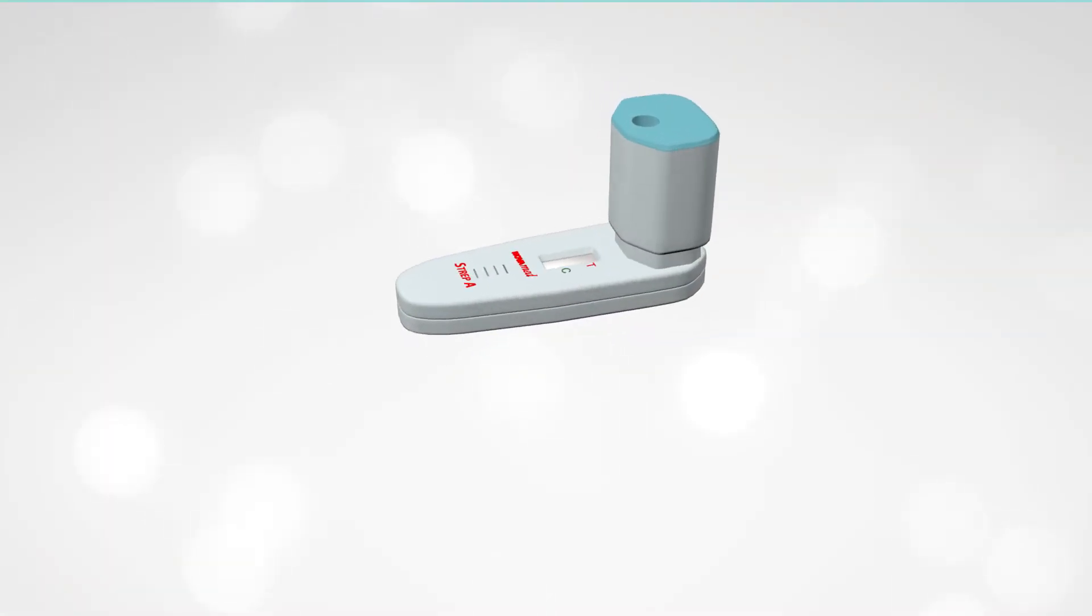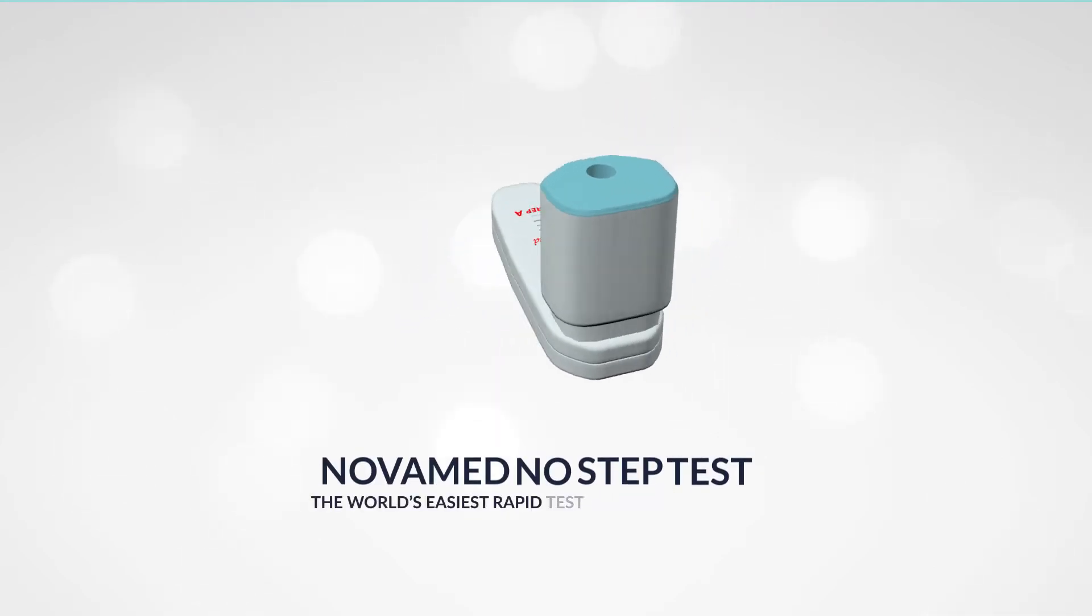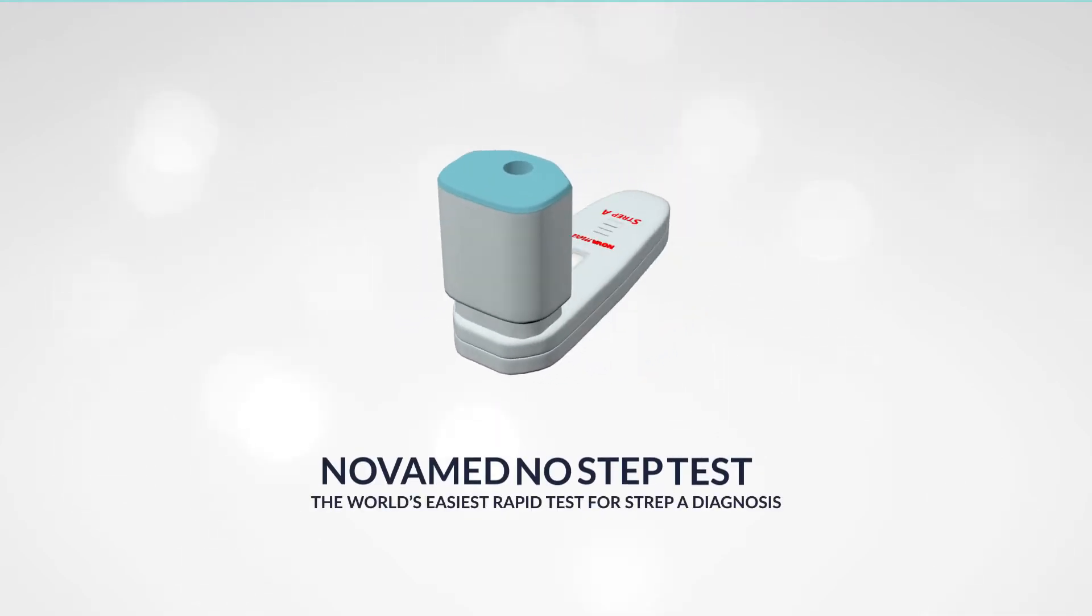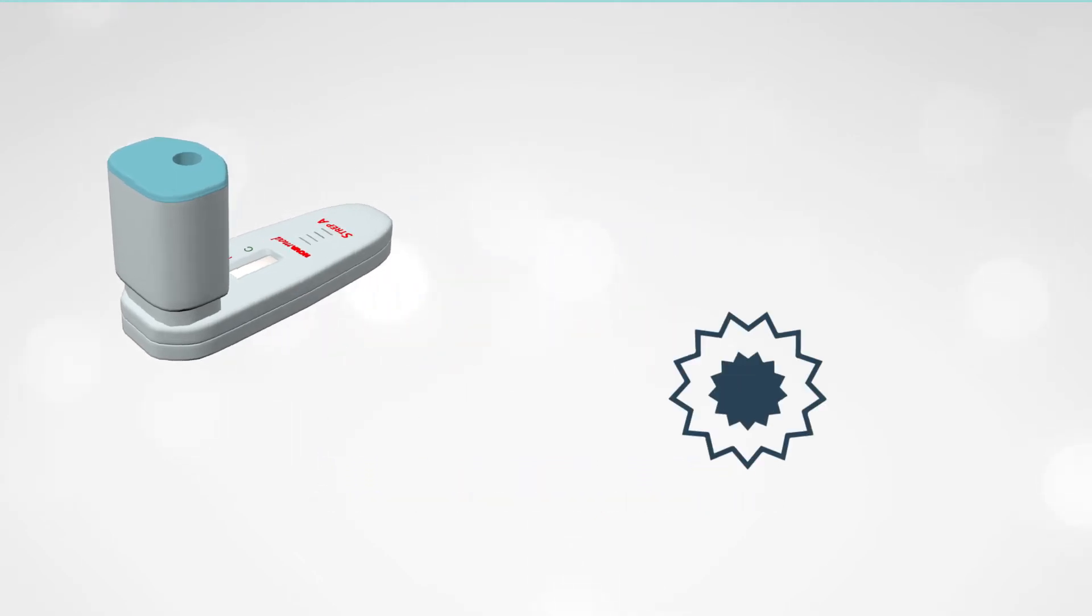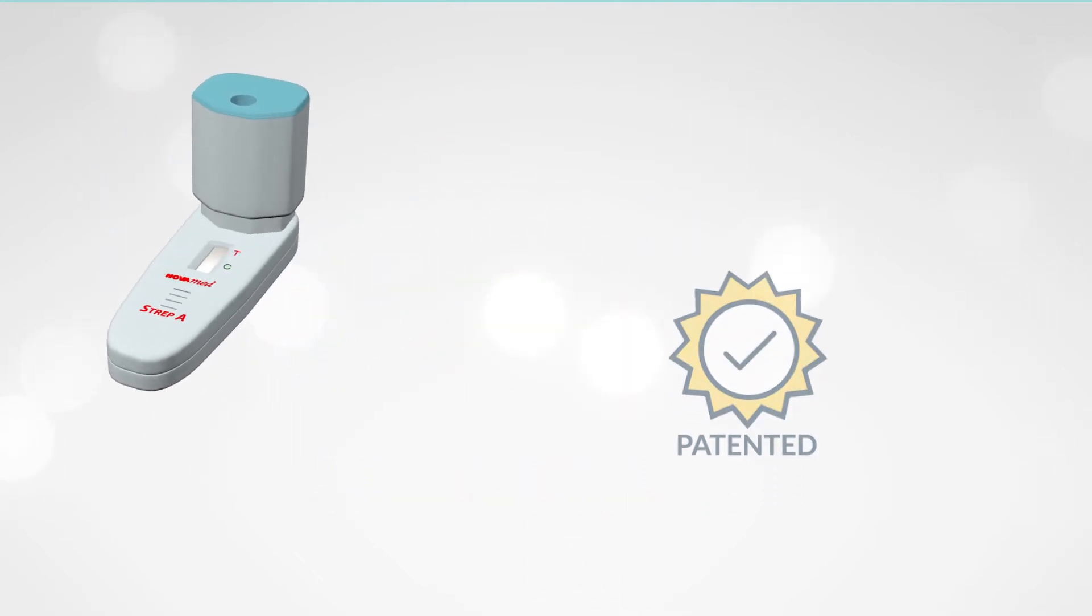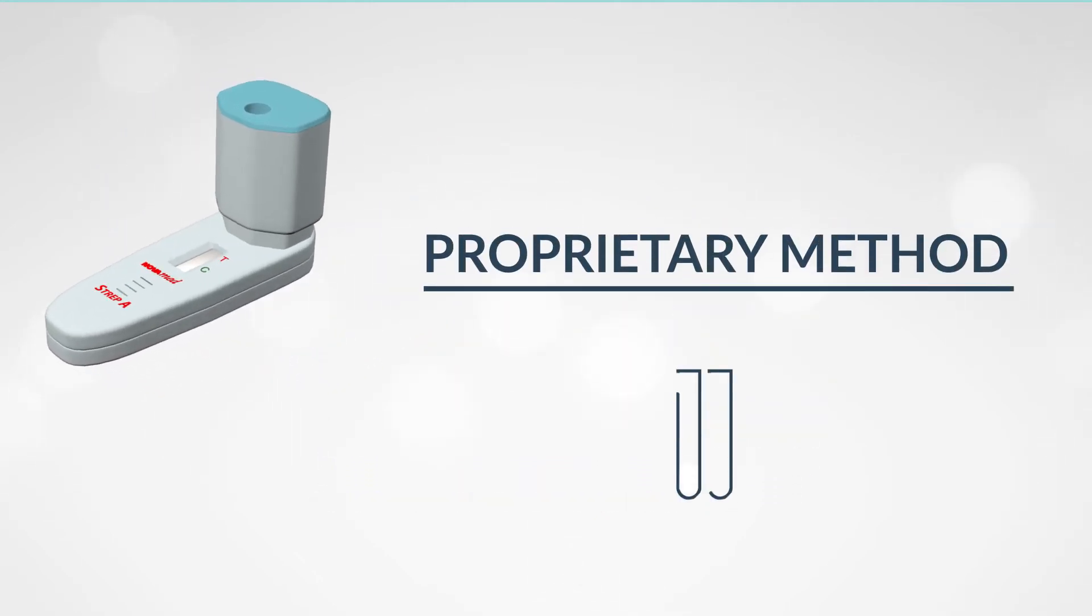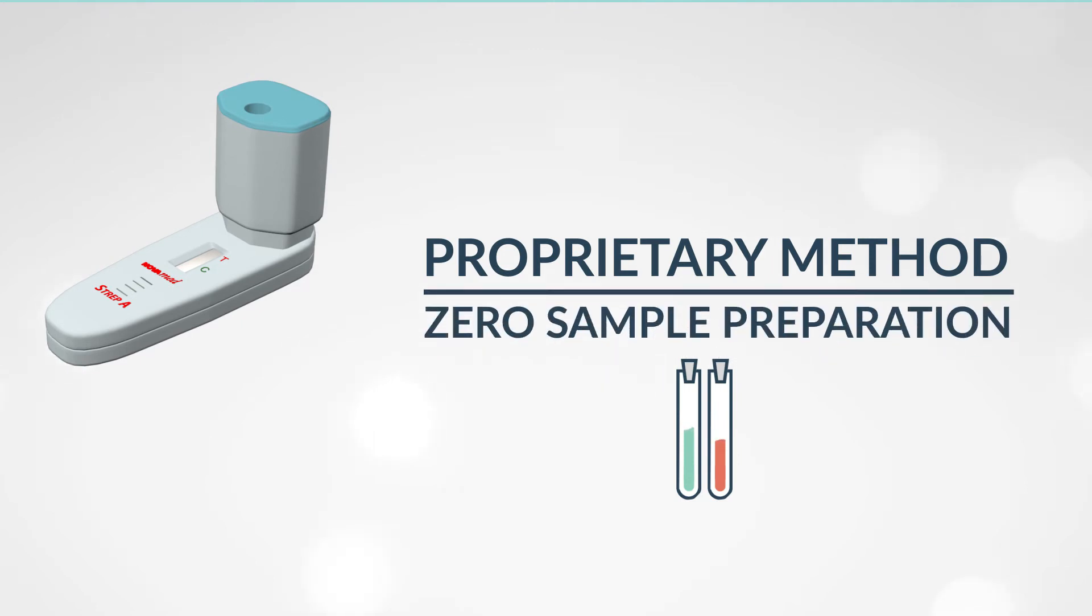Introducing Novamed's No-Step Rapid Test for Strep A. Novamed's No-Step is a patented rapid test, packaged in a proprietary method, which requires zero sample preparation and delivers consistent results every time.